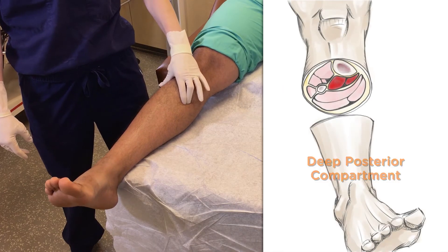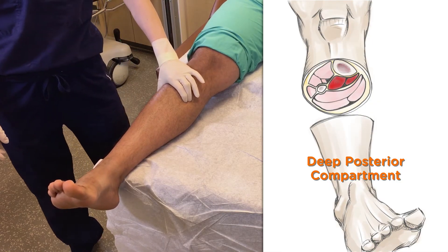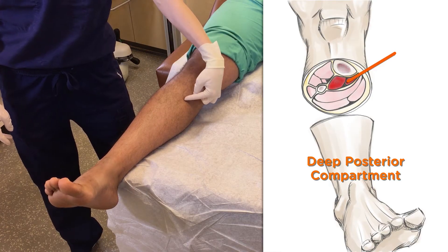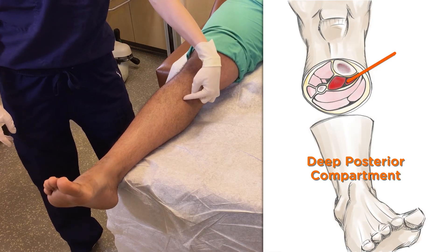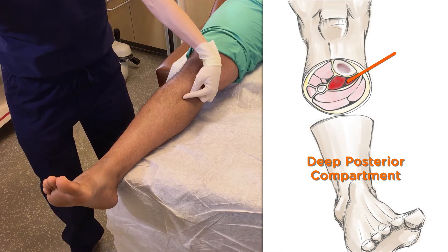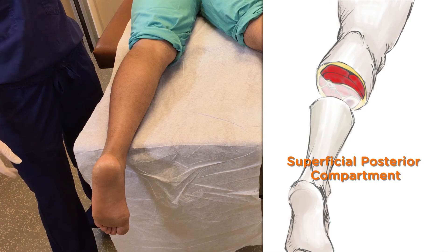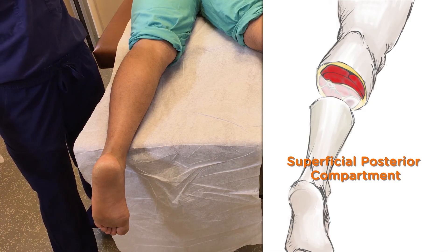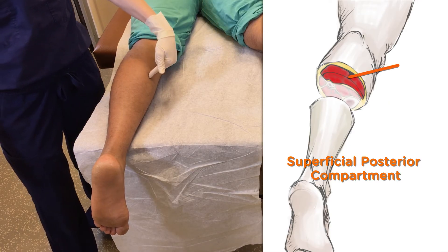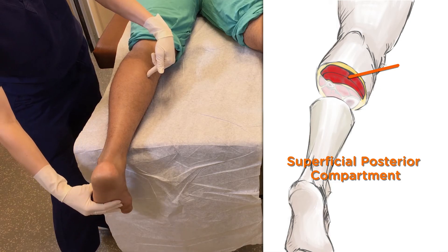Aim for the deep posterior compartment by grabbing the medial border of the tibia on one side and the lateral border of the fibula on the other side. Insert the needle medially, aiming towards the posterior fibula, and go about two to four centimeters in. The pressure should rise with extension of the toes. And finally, the superficial posterior compartment — go three to five centimeters off midline and insert the needle two to four centimeters deep. The pressure will rise with dorsiflexion of the foot.